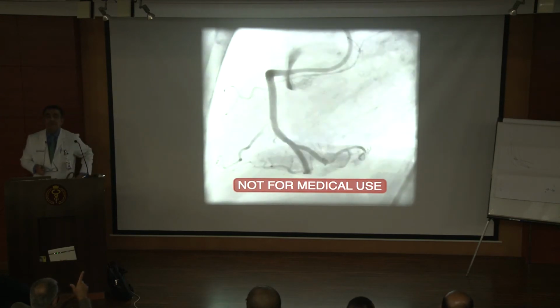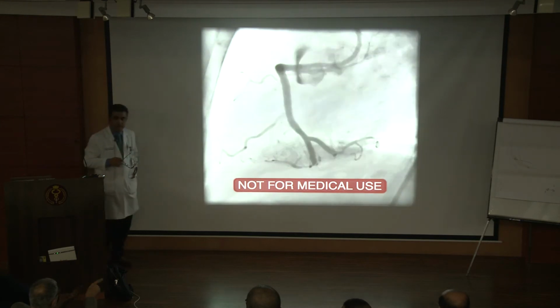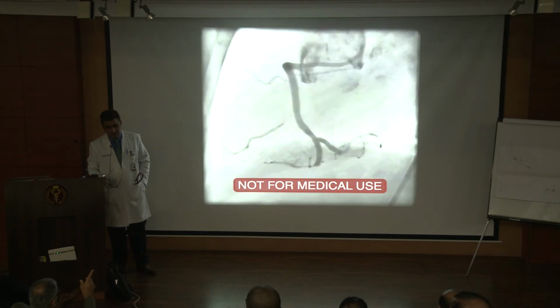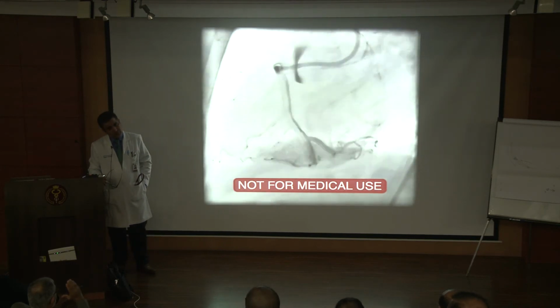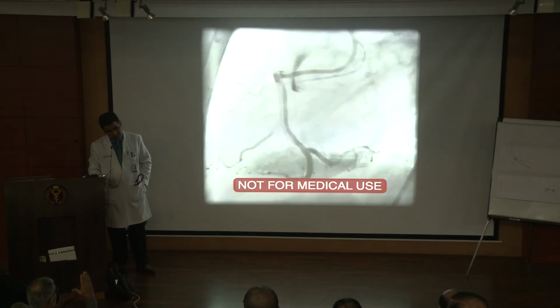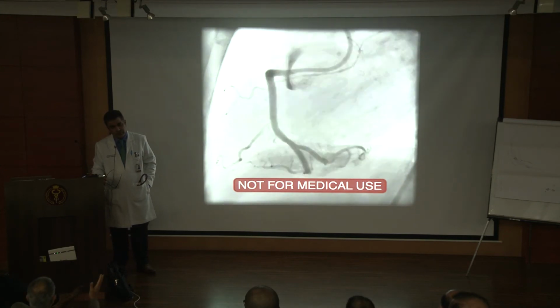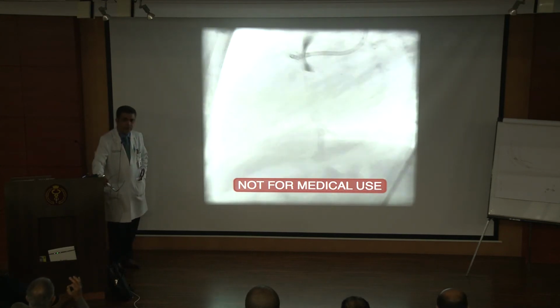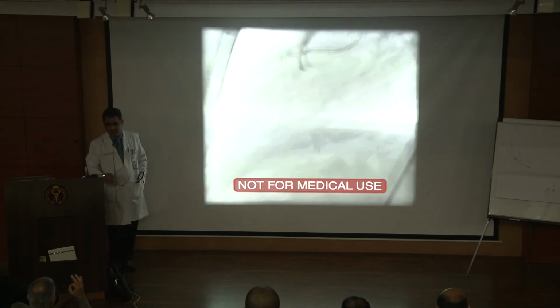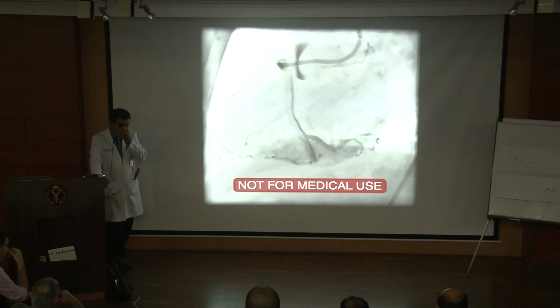I ask you, what do you use when you're already working on a retrograde case, trying to stent all the way to the ostium? How do you decide where your stent is going to be, and you're not going to use any antegrade injection to tell you where your ostium is? What tricks do you use to be sure that you're covering the ostium?